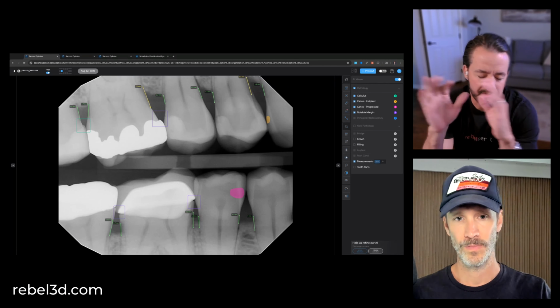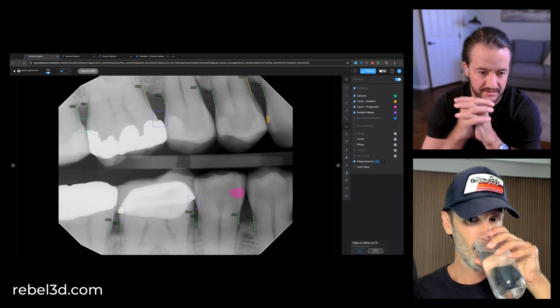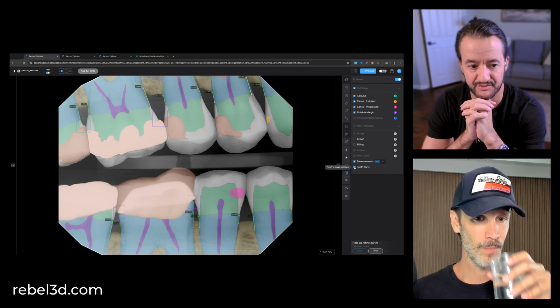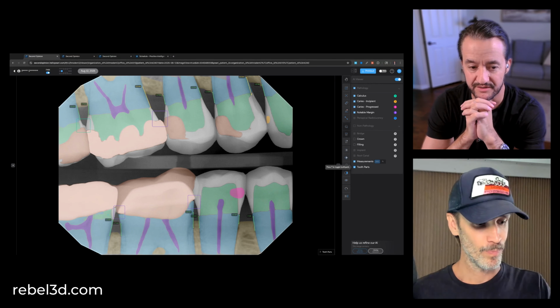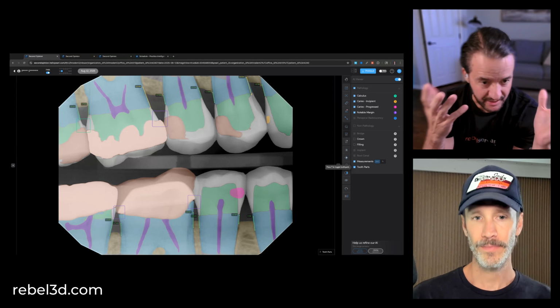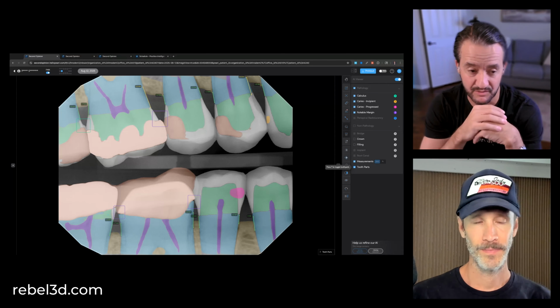That two-dimensional photo that you showed with all the colors, that is very patient-friendly. And this objective conversation around here's the root, here's the dentin, here's the enamel, now becomes a much more meaningful, trusted conversation, putting it in a language the patient can comprehend. Now you're having a conversation on the same plane versus just human to human talking. Exactly. It's not the conversation of I'm your dentist, I know how to read the radiographs that you don't.